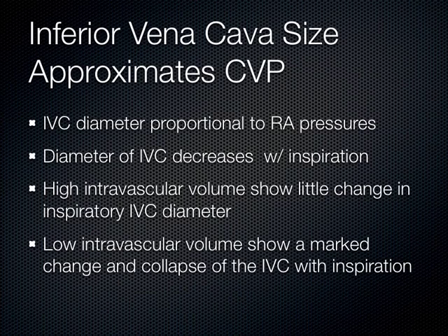It's pretty cool. But if you've got a lot of fluid, if you have congestive heart failure and your fluid overload state, and when you breathe in, your IVC doesn't even budge, and it's really dilated, you need diuresis, or you need to take a medication like Lasix to get rid of some of that fluid, to pee it off, okay?